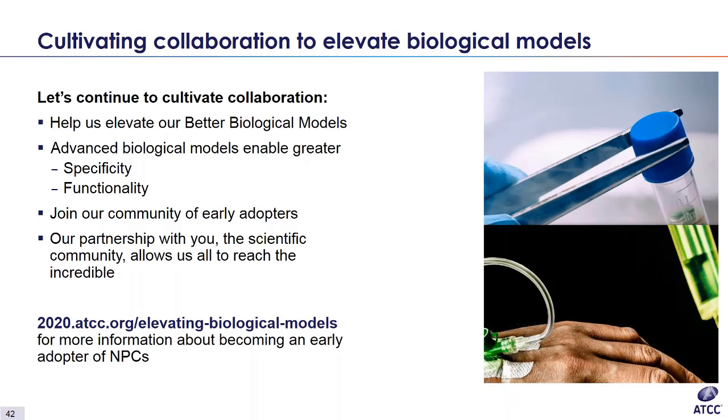Our next question is, what is the optimal cell confluence when passaging NPCs? It's a good question. Unlike other primary type cells, passaging neural progenitor cells near 100% confluence does not affect cell performance. We highly recommend passaging NPCs when they reach about 95% confluence. Do not split the neural progenitor cells when they're less than 85% confluent, as that will inhibit the cells' proliferation.